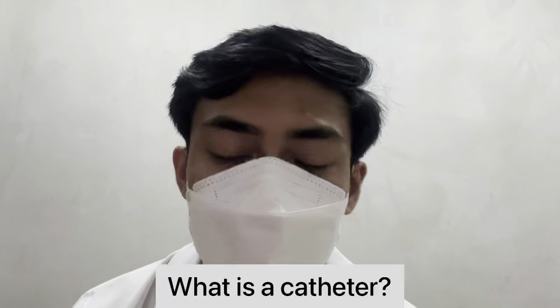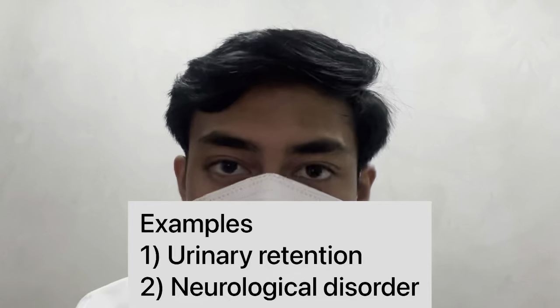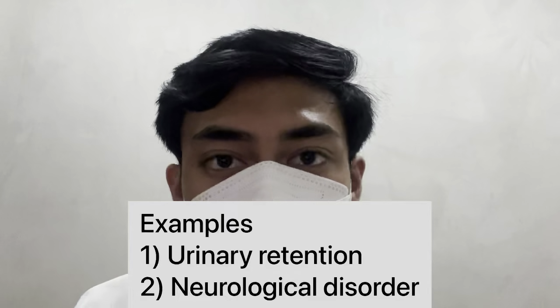First and foremost, we need to understand what a catheter is. A catheter is a medical device that helps patients who are unable to urinate properly. For example, a patient with urinary retention, or patients with neurological disease that causes them to be unable to control their urinary bladder. This causes them to urinate at random times. Now there are actually 4 types of catheter, but in this video I'll show you only 3 types.